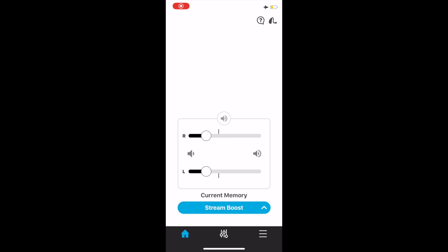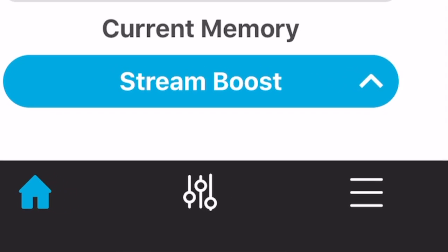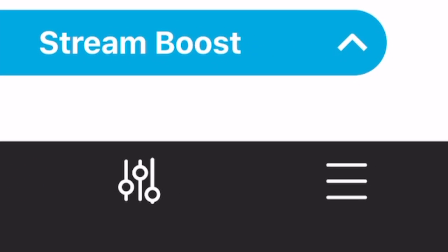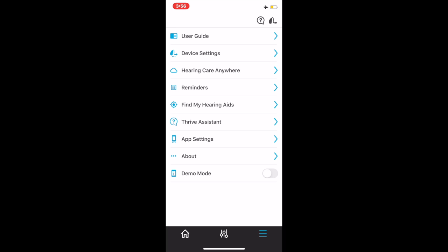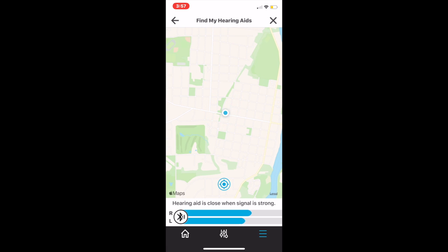The final section in the Thrive app at the very bottom right is what we call the hamburger menu, the three lines horizontal. If you click on that, that will bring you to many different options, your user guide, device settings, etc. The one you're going to use the most is the Find My Hearing Aids.